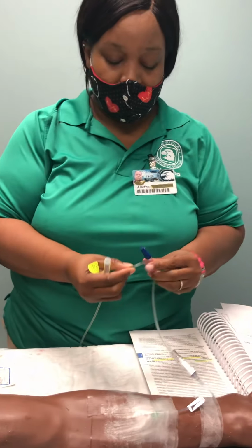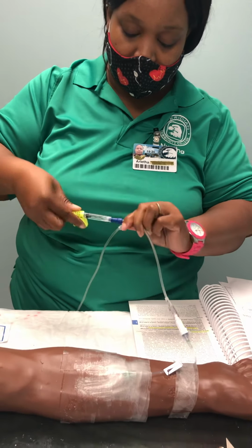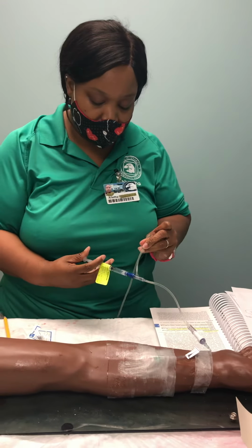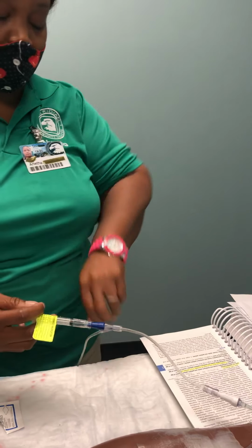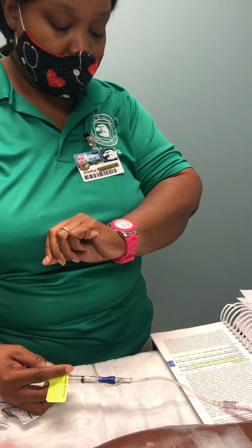I hook my medication. Okay. All right, I clamp and I push 1 milliliter of this medication. I unclamp. I am going to monitor for 2.5 minutes, starting now.